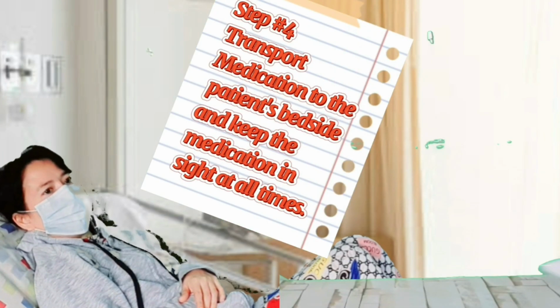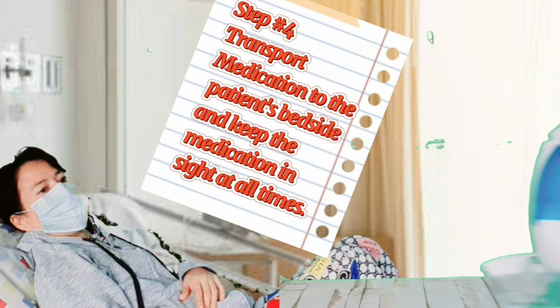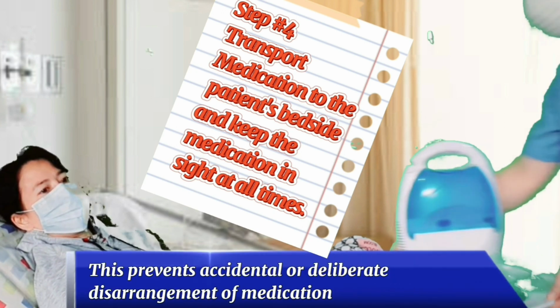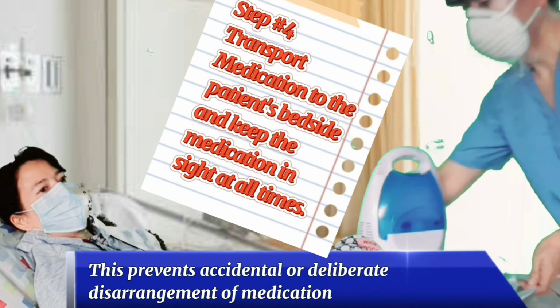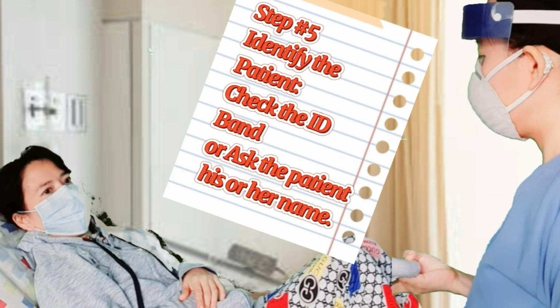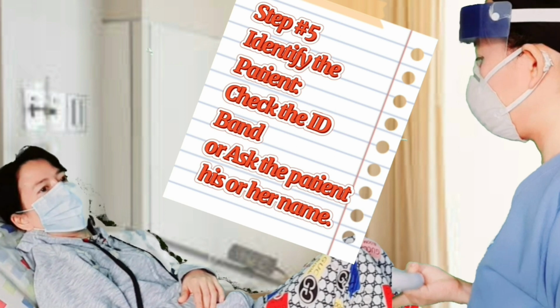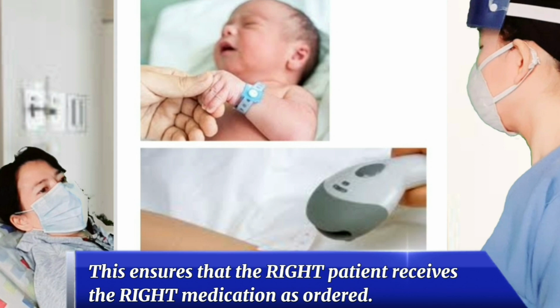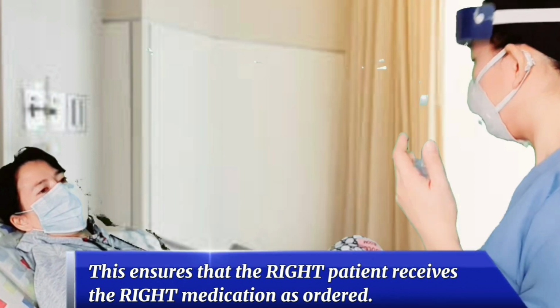Step number 4. Transport the medication to the patient's bedside and keep the medication in sight at all times. Careful handling and close observation of medication tray for certain patients prevent accidental or deliberate disarrangement of medication. Step number 5. Identify the patient by checking the identification band or ask the patient his or her name. This ensures that the right patient receives the right medication as ordered.